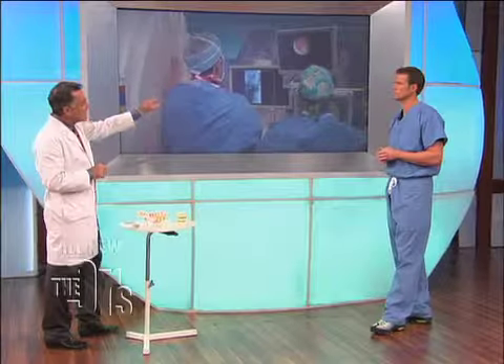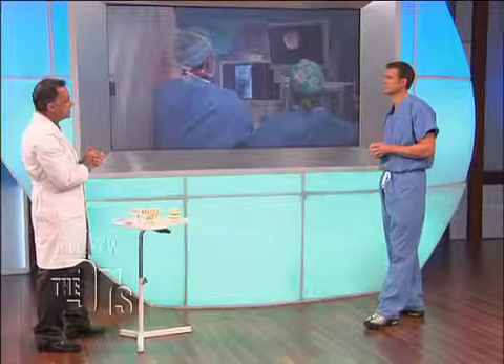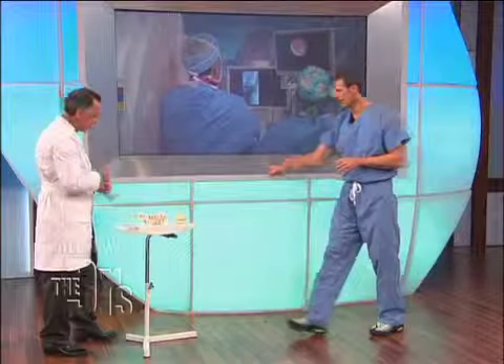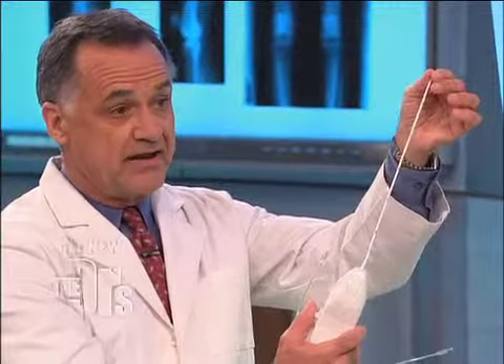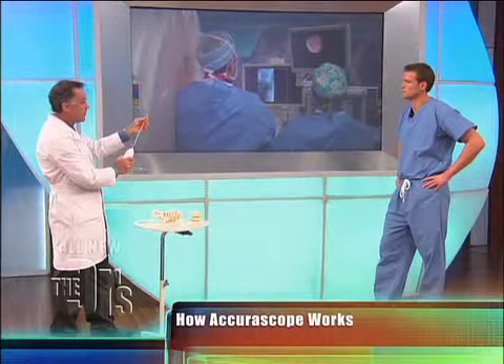The key part of this screen is the upper right — the little white circle with the red in it. That is the picture we're actually seeing from inside the spinal canal, coming from this catheter. This is what we call the AcuraScope. Through this really small catheter, we have an endoscope camera connected to the monitor, and we also have the laser incorporated in there as well.